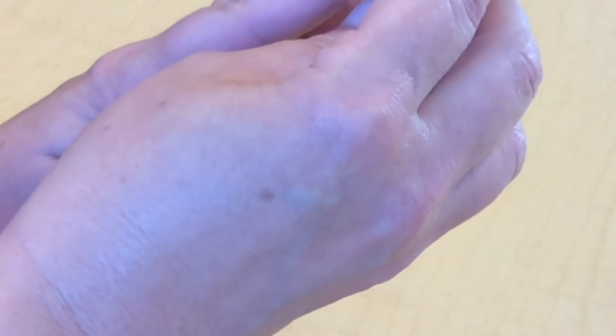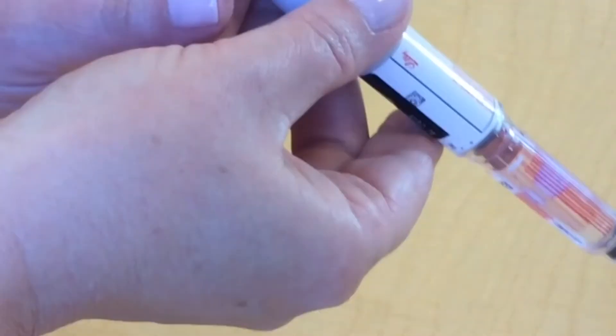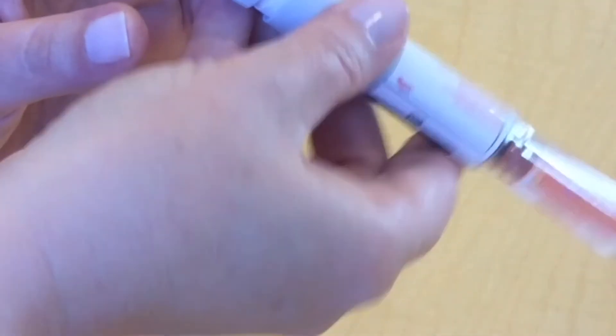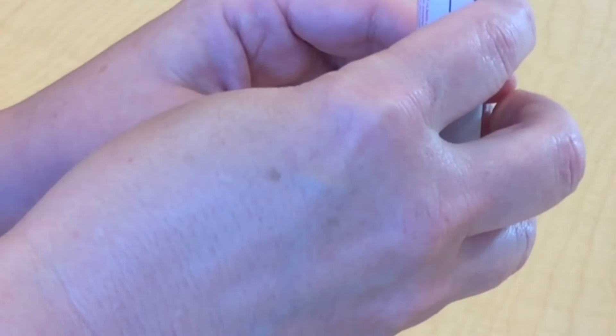Then, grasp the non-insulin end of the pen and invert it 10 times. Do not shake your insulin pen.